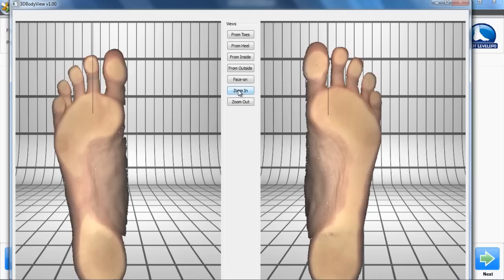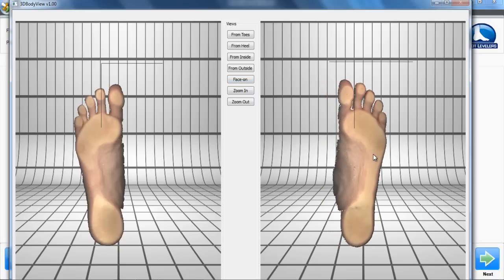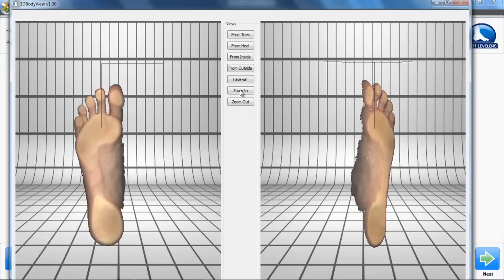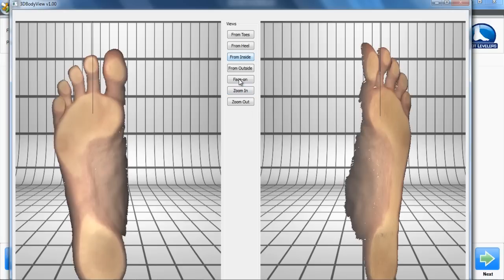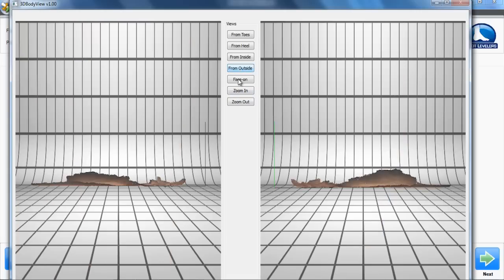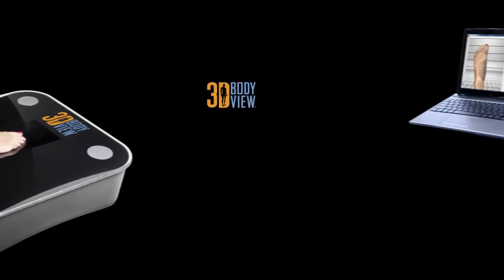3D BodyView is the first system to deliver a crisp, true color image, as well as view patient assessments in 3D. The 3D Viewer allows you and your patients to see their feet in a whole new dimension. 3D BodyView provides real clinical insight by showing areas of deformity, levels of asymmetry, and abnormalities between the left and right foot.